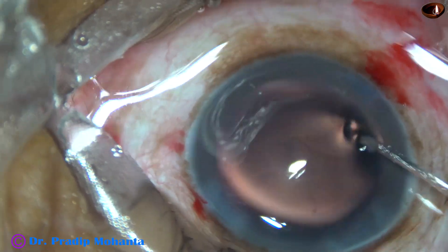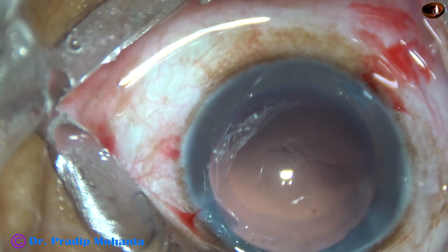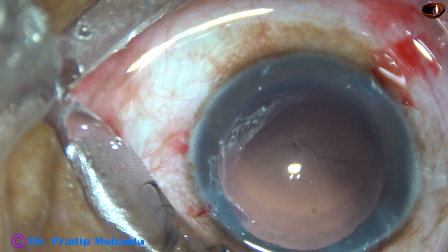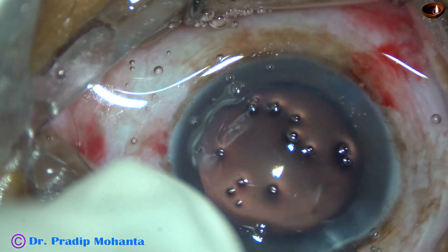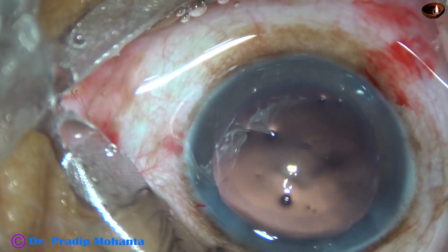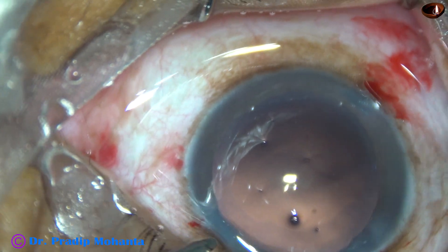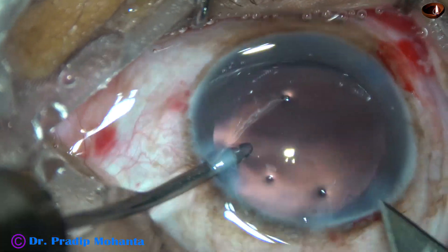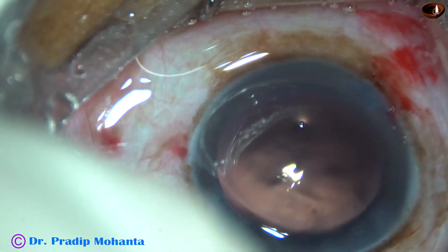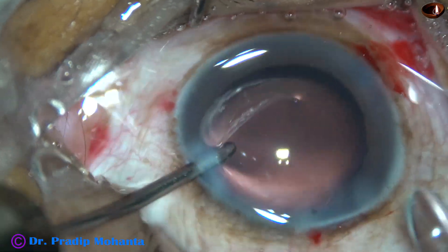Now is the time to implant an intraocular lens. I am going to use a B cartridge, and for that I need to enlarge the main wound. I have asked for the keratome, and this is how you enlarge the main wound — just two cuts to enlarge the wound to about three millimeters.